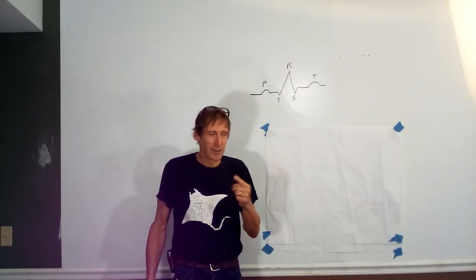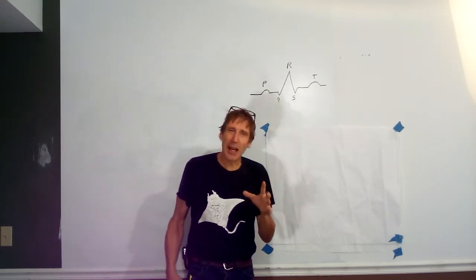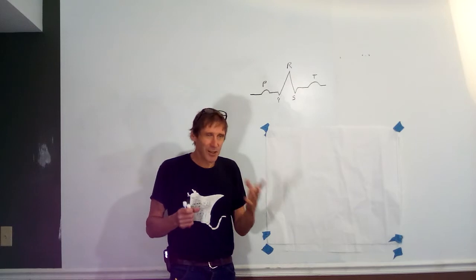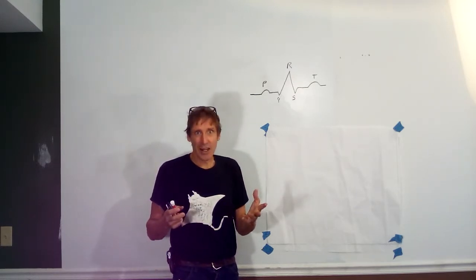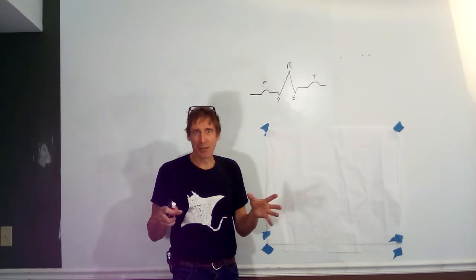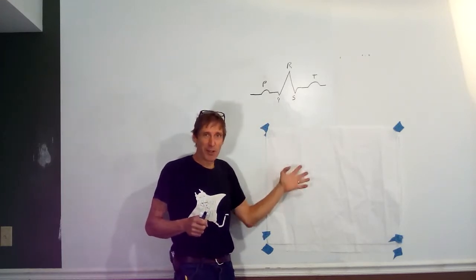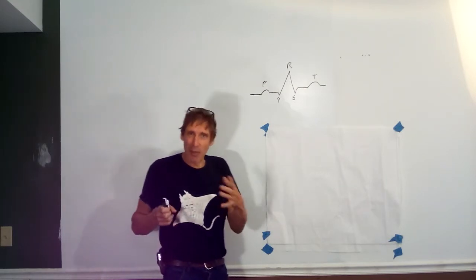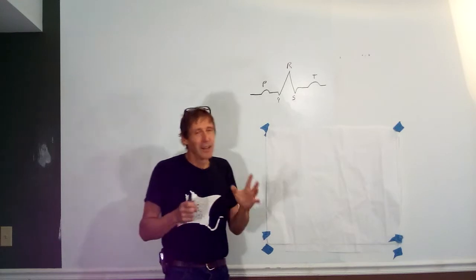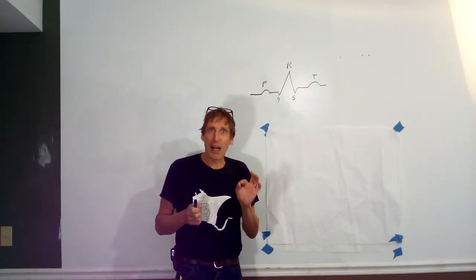One reason, this instructor probably can't really do it. I can look at it in general, but honestly, to interpret EKGs, cardiologists go to a lot of school. They can do it. You can't learn it in an hour. I can't teach you it either, in 15 minutes or whatever we've got here. So I've got some extra pieces of paper here. I may give you some tracings of what an EKG might look like or how it's affected. It may not be all that accurate, and you're not going to have to identify or interpret abnormal EKGs.